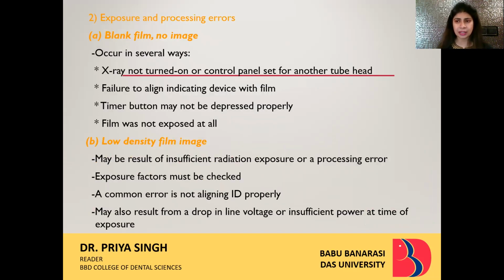Then coming to the second category, that is the exposure and processing errors. As I have told you earlier also, if the technique has been done properly, but if exposure or processing errors are there, it will lead to major artifacts.